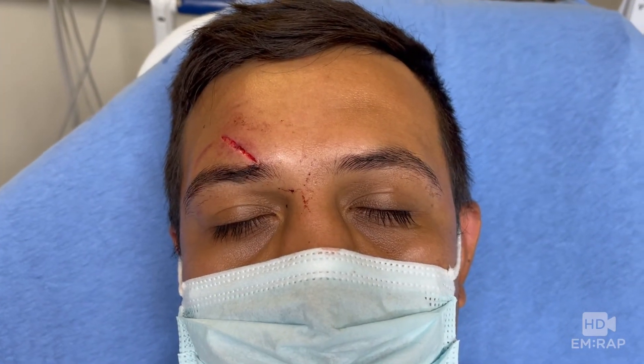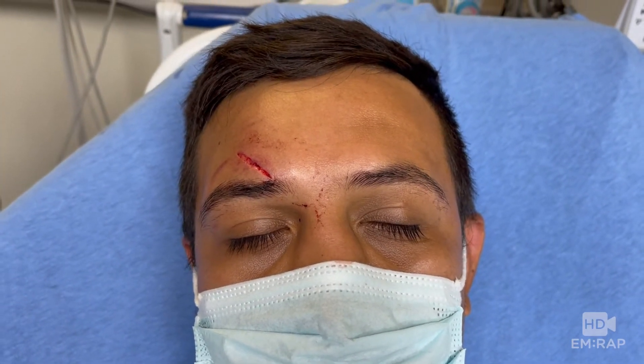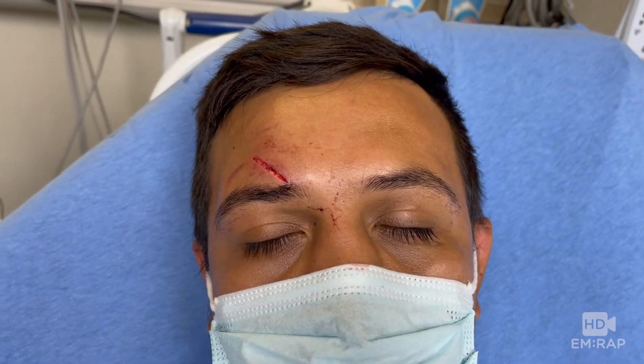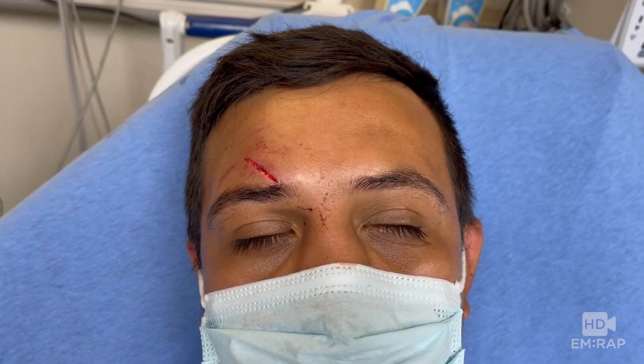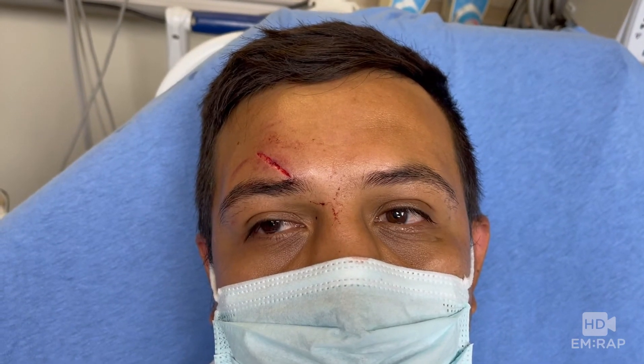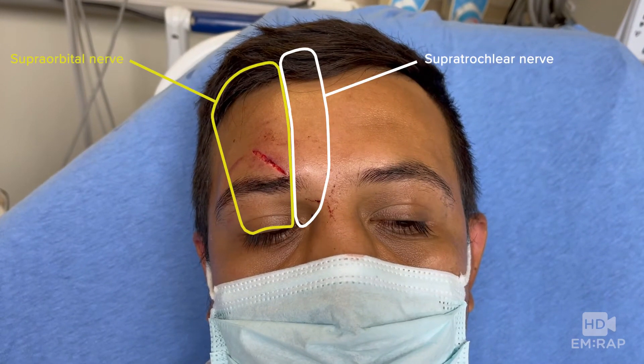A supraorbital nerve block is a great nerve block for anesthesia of the forehead and the upper eyelid, which is perfect for this patient so we can repair that forehead laceration with just one injection. To be correct, this is not actually blocking just the supraorbital nerve — it's also blocking the supratrochlear nerve, which provides sensation to the more medial portion of the forehead and eyelid.